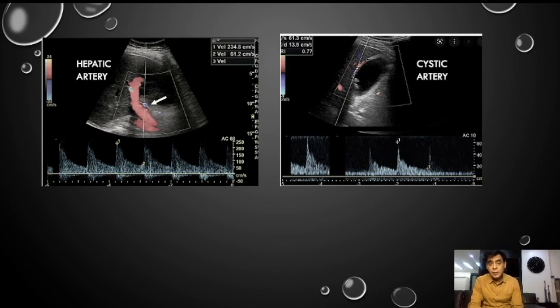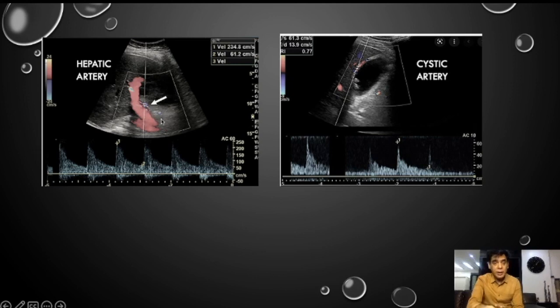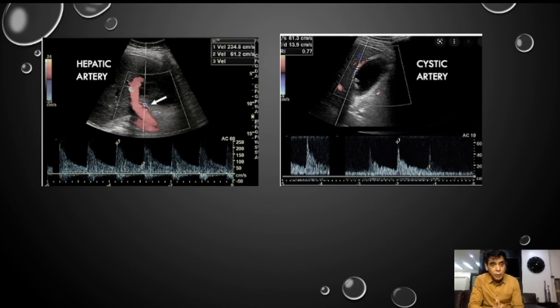Now let us see hepatic artery Doppler. First, where to do the sampling. Now where you find the portal vein, as in this picture you can make out the portal vein is here. Parallel to that you see the common hepatic artery or the right hepatic artery. That is the point where you do the sampling.